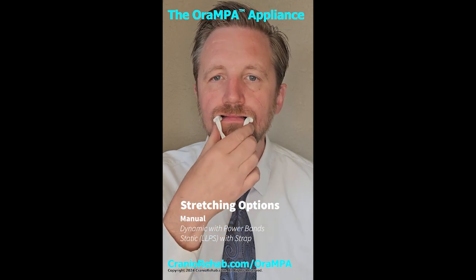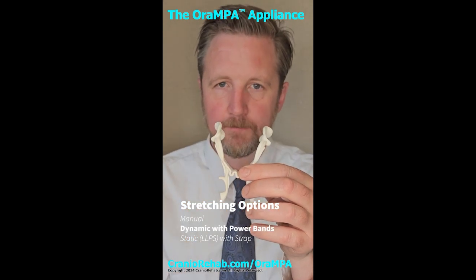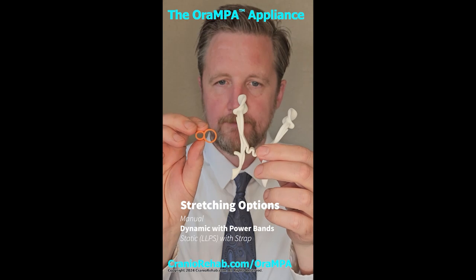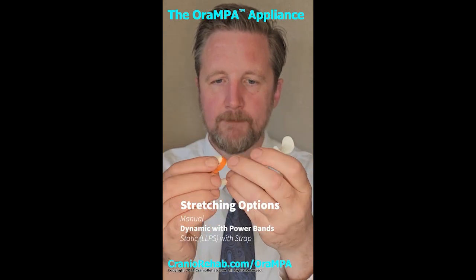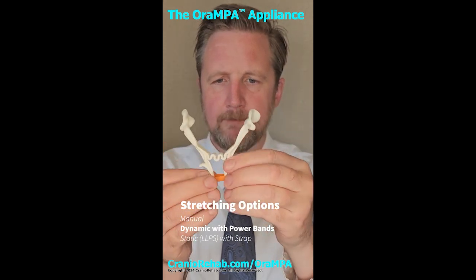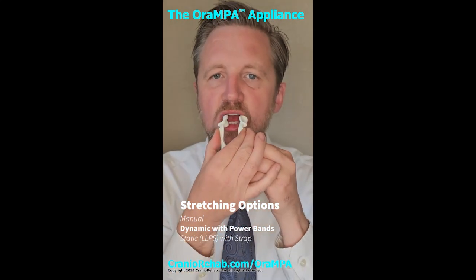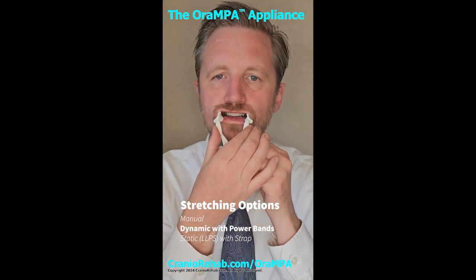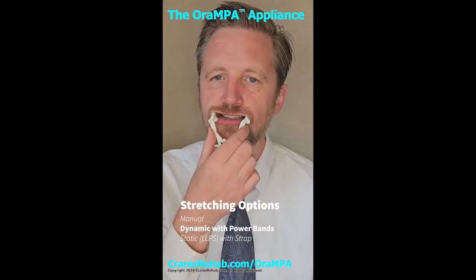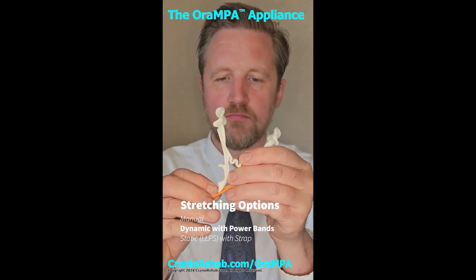Okay, so now we're going to go ahead and show you how to use that same device, but with the power bands. So these dynamic bands, they fit on the arms of the device. There's 2 different sizes there. So Rob's going with that bigger size. Then he squeezes that top area together again and inserts it, and he allows it to do a dynamic stretch. So there's a little bit of flex in there because it's using that band. So he can actually push against it if he chooses to.